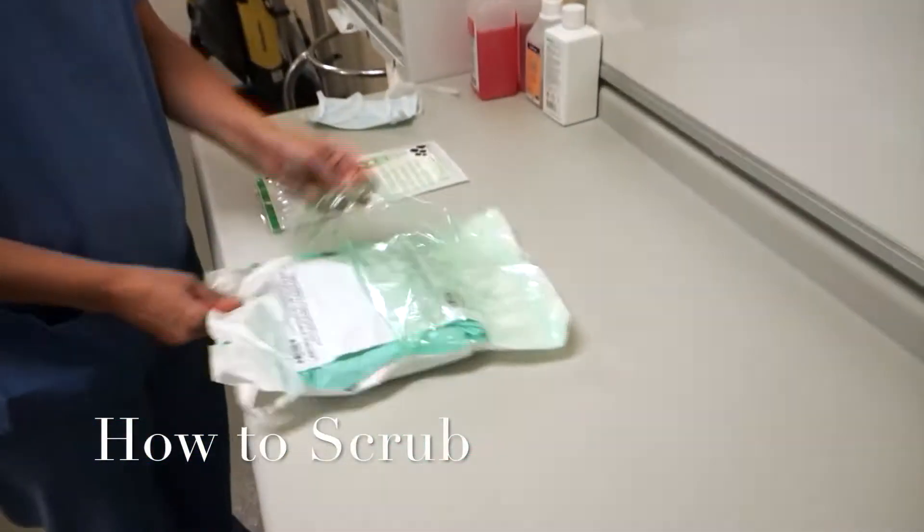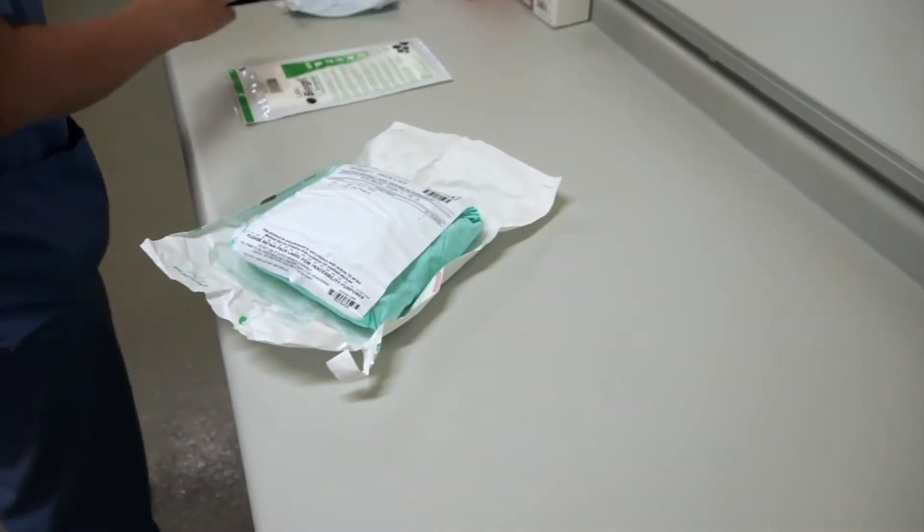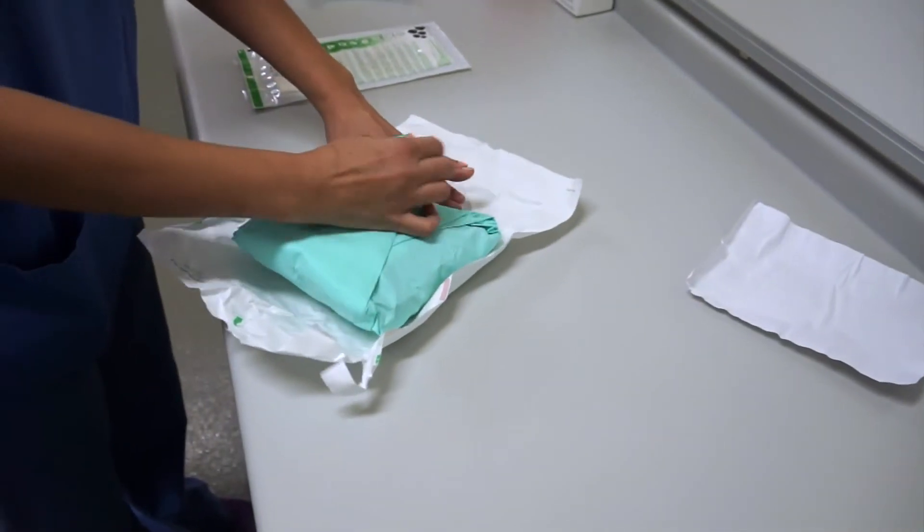Okay Helen, so what we're going to do is get ready for scrubbing first. So tell us what you need to do to get ready to be able to scrub. So what you need to do, as I've already done, is put my eye protection on.